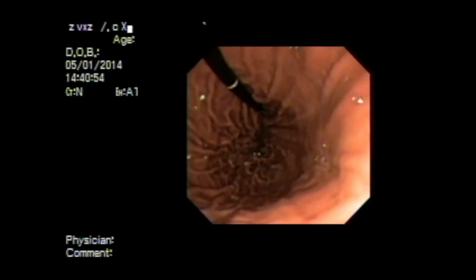Finally, in this case, the POEM tunnel dissection was noted to be difficult, secondary to previous endoscopic Botox injections. The pediatric endoscope was introduced into the esophagus and stomach. The dissecting scope light is observed in the distal esophagus while the pediatric scope is passed. The endoscopic dissection light was not originally observed within the gastric lumen.